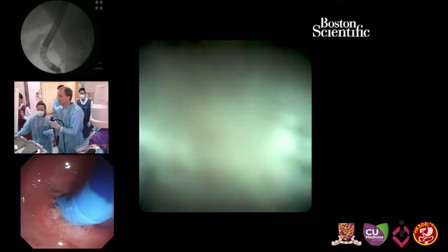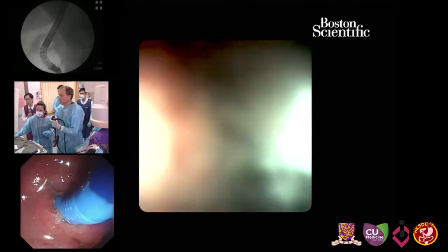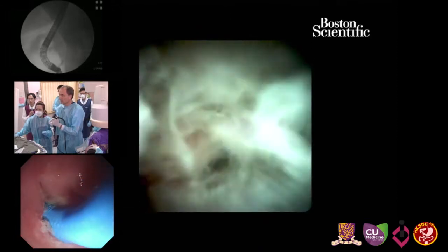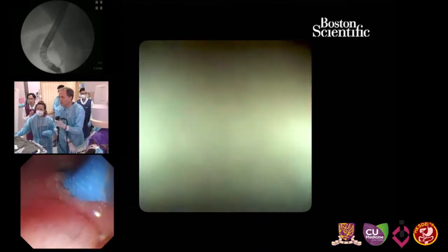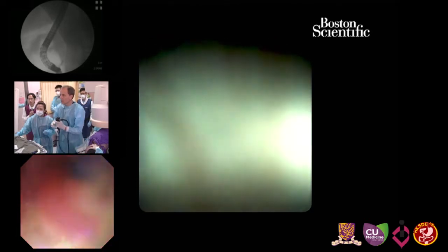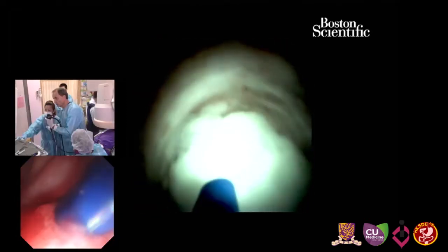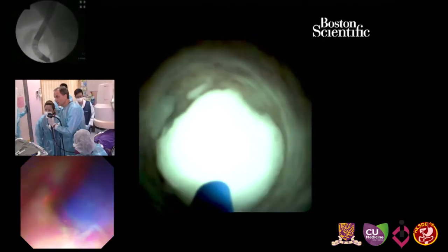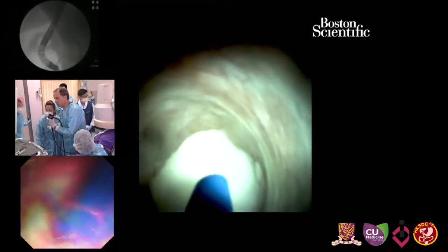Keep on flushing. Yeah, we keep on flushing. But this is not yet the duct again, so I pull it back a little bit. Now we are deeper in the duct. Okay. Horst, yes, so you're back. So now we are in front of the stone.